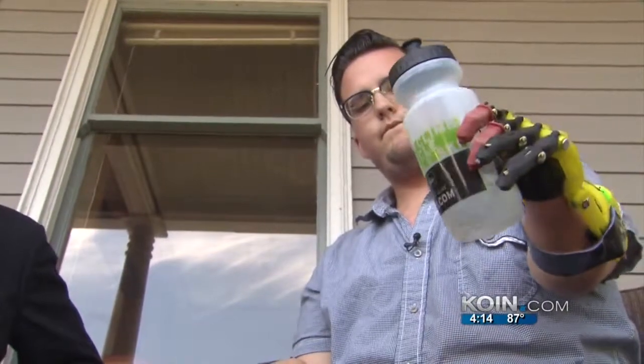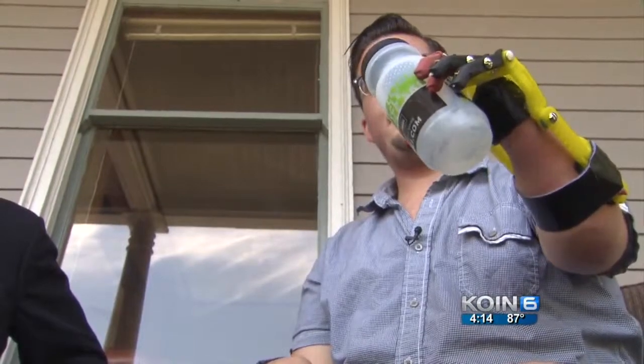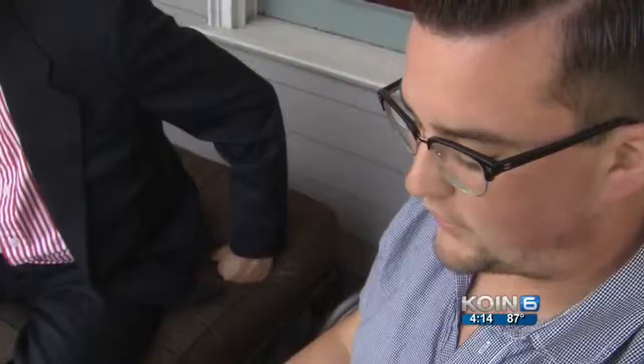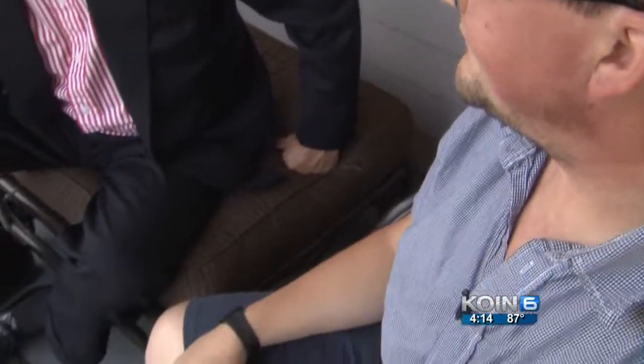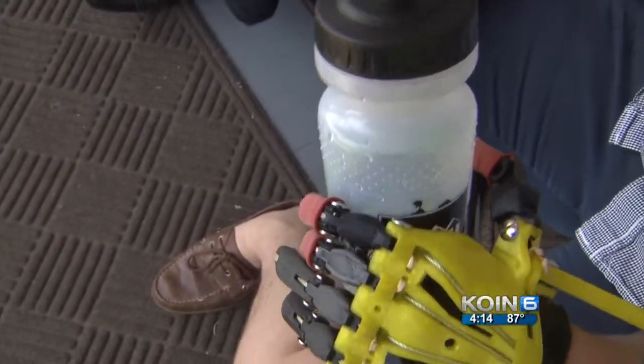Jordan is now able to do simple things like peel an orange or hold a bottle of water. Down the road, he hopes to develop an app that can scan the extremity of the arm, send an image to a 3D printer, and then build a completely customized hand for whoever needs one.